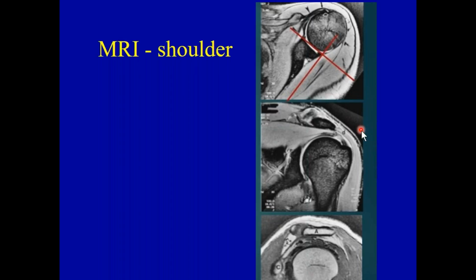Now, the point wasn't to bore you with the anatomic details, but just understand that the more sensitive the tool is, the more information we're going to get from it. Shoulder x-rays aren't going away, probably because they're the first plan of attack radiographically, and they're less expensive.